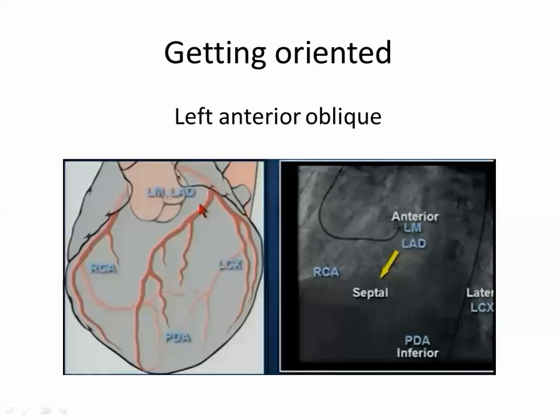So this is the RCA. As we said, it is the right atrioventricular sulcus, and from behind this is the continuation of the RCA, as you see, to give PDA and PL, in the faint color, okay, this is from behind.